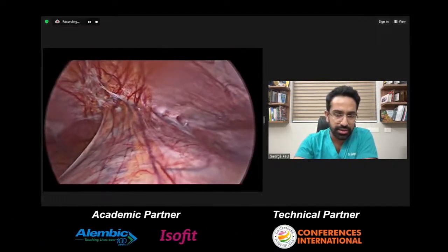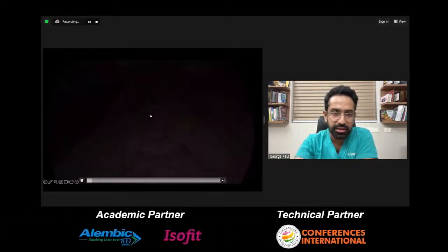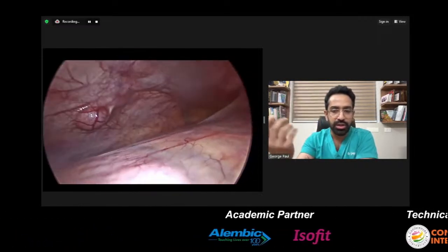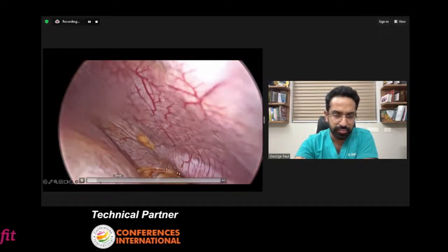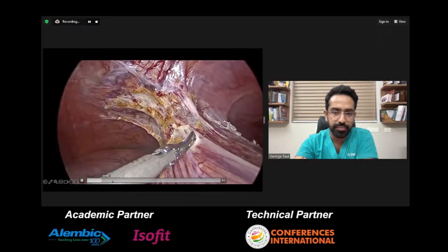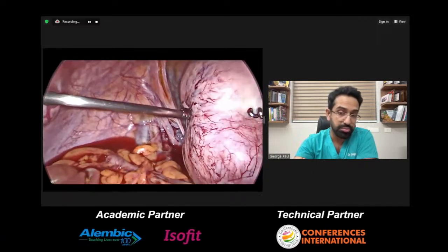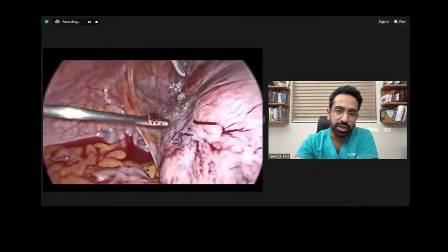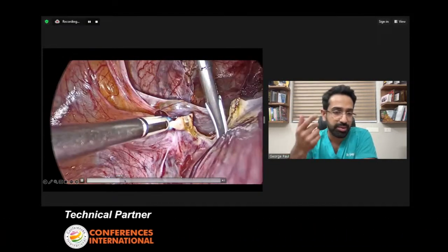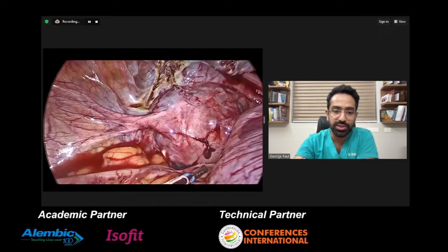This is another case again, as you saw in the image. This patient had undergone a myomectomy before, and these were two parasitic myomas, one attached to the anterior abdominal wall, and one along the side. So this is me separating the parasitic myoma. With all these large ones, it mostly will have a large vascular pedicle. So that is something that you have to be careful about. I know that I'm repeating that multiple times because that is something that you tend to underestimate at times when you do surgeries like this.